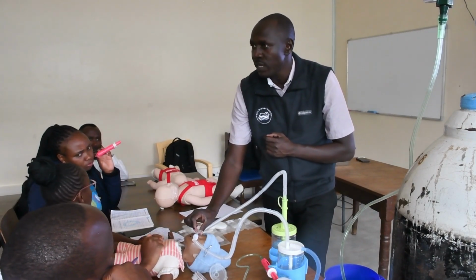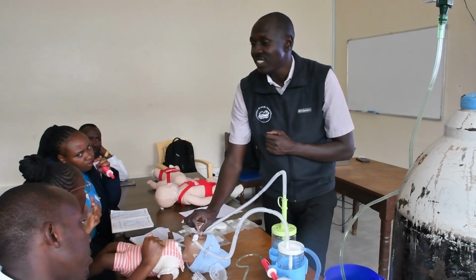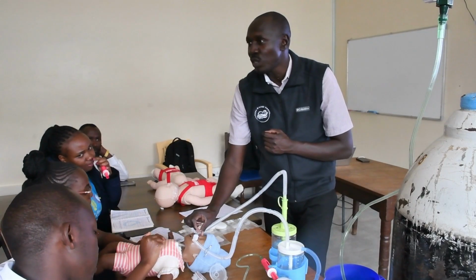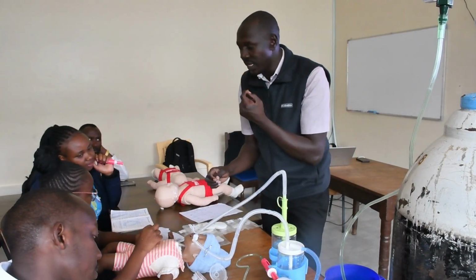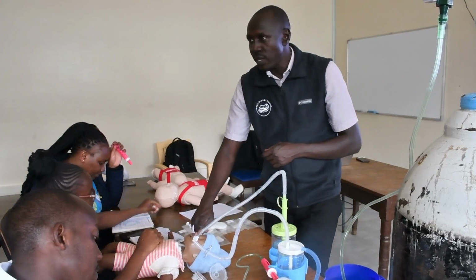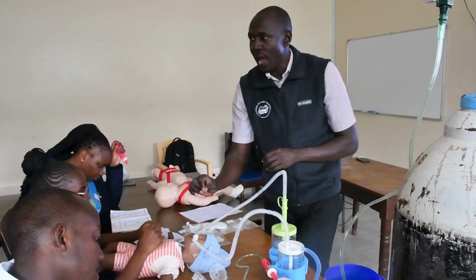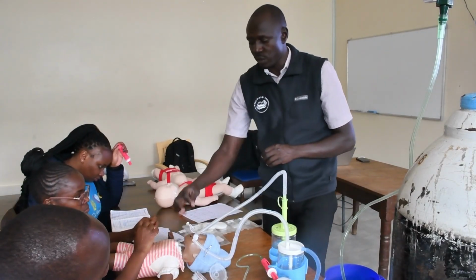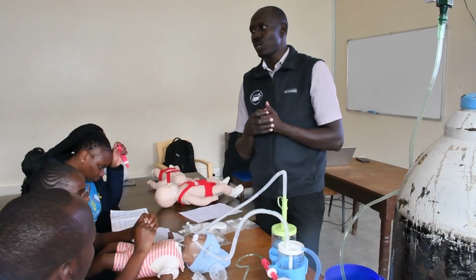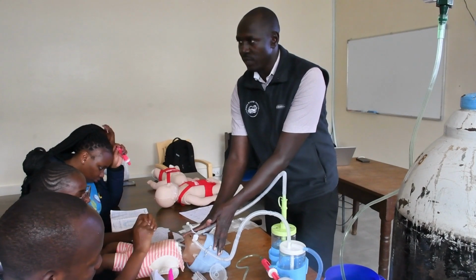At least how many millimeters? How many centimeters? 2 to 3. Yes. So in that way, you are able to prevent nasal injuries. Apply some saline drops in both nares to keep them moist. So this is monitoring the device, monitoring the patient.